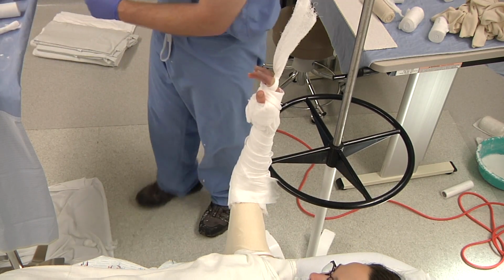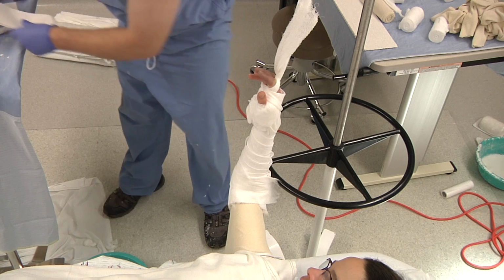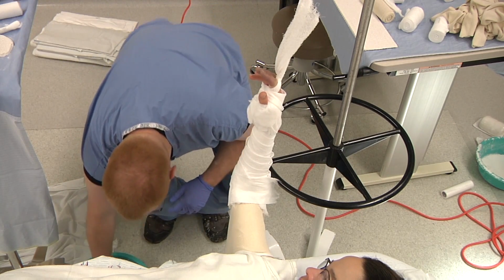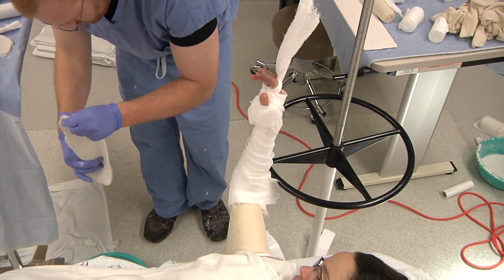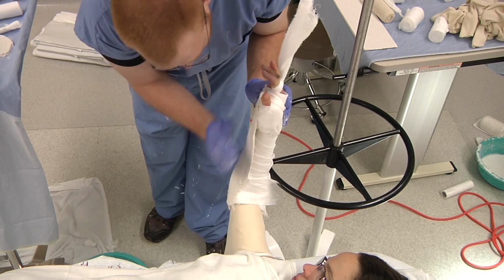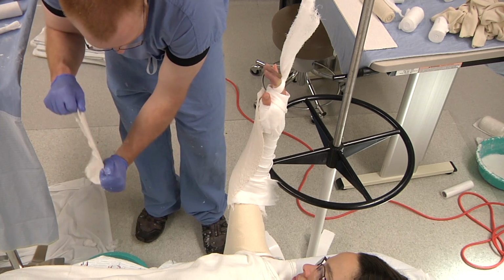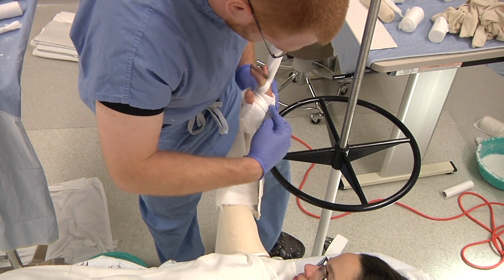From here, we'll take our plaster, and starting with our one that we have specially made that has a little bit of a thumb recess. Laminate, laminate. Apply that, making sure to know where you end at the top. Around. Proceed to your dorsal. Make sure to be cognizant of where you're ending.